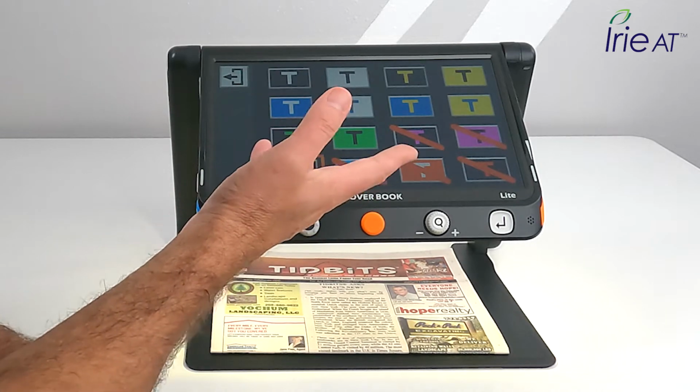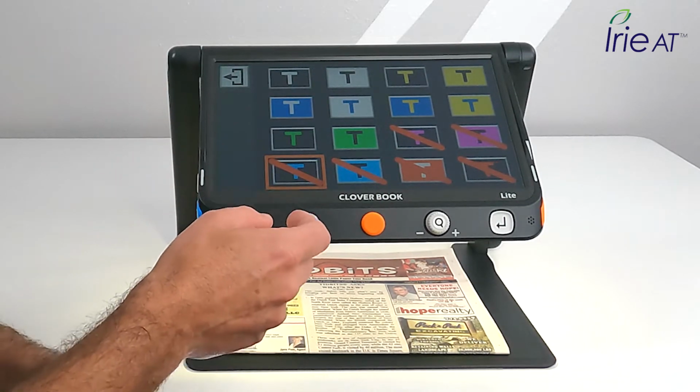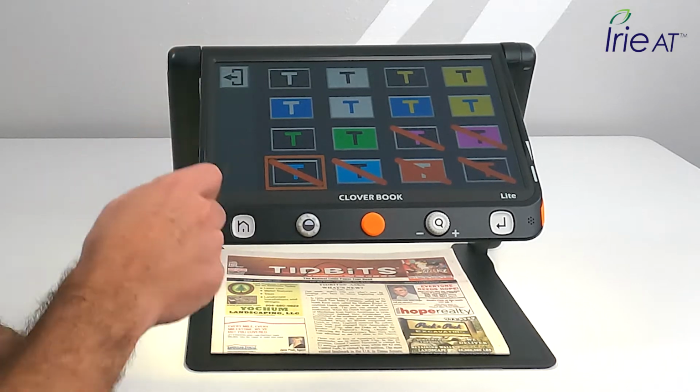I just touch them to get the cross out of them or the slash out of them, and then they put a slash across them, and then I don't have that contrast color anymore. So you can limit it to just the ones you want.